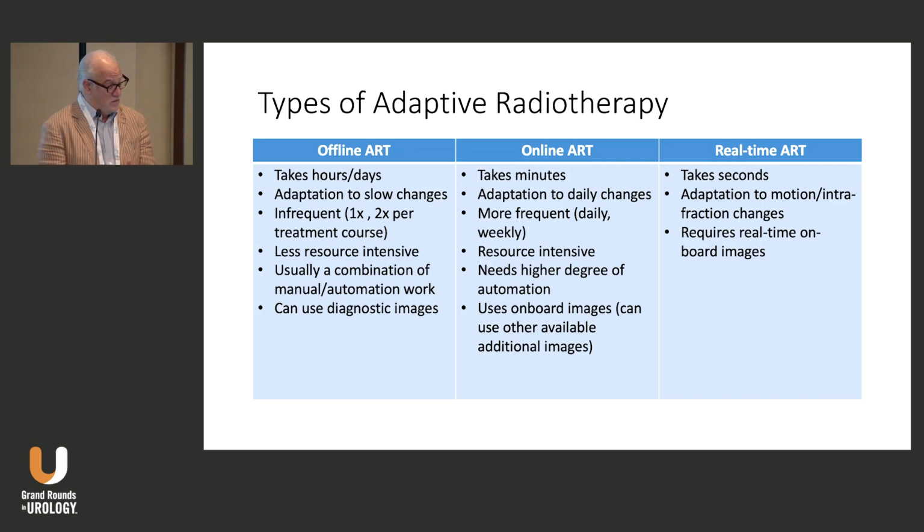So what we do is we will take a CT scan. We will outline all these structures: normal structures, the prostate, bladder, in this case for prostate cancer, rectum, small bowel, anything that we want to put in there. We then hand this information, the CT scan that can be looked at in 3 dimensions, to our physicists, and they will design how the linear accelerator will deliver that radiation.